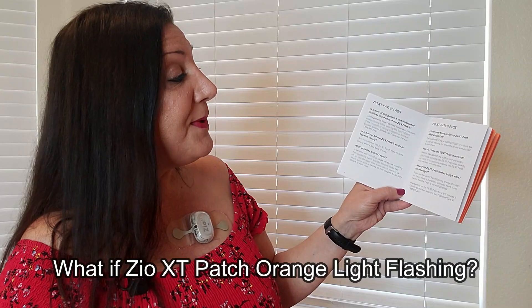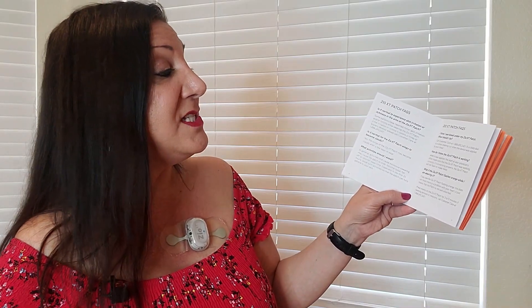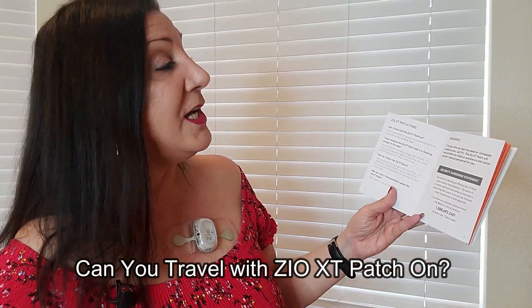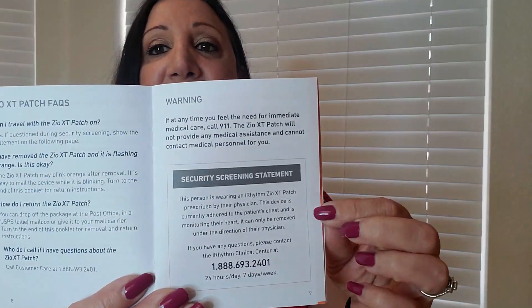What if the Zio XT patch flashes orange while you're wearing it? If you see it flash orange, this does not mean there's a problem with your heart — it just means the patch is not well attached. Press evenly on the patch for three to five minutes, and if flashing persists or reoccurs, call customer care. Can you travel with the Zio XT patch on? Yes, and if questioned during security screening, show them the statement provided in the booklet.